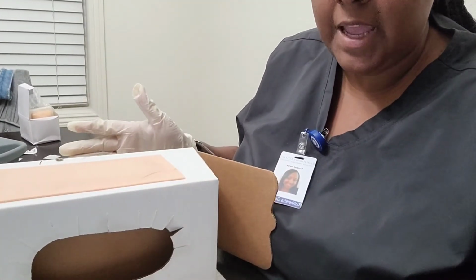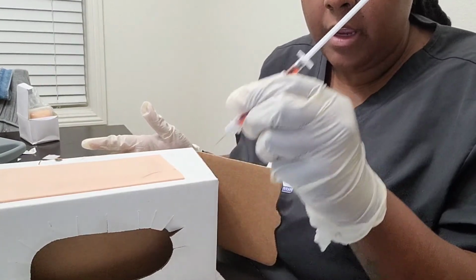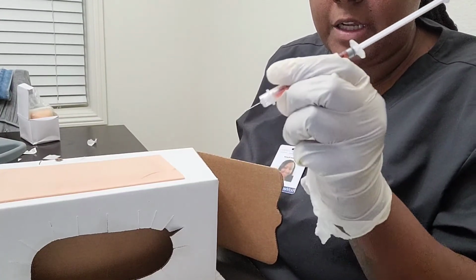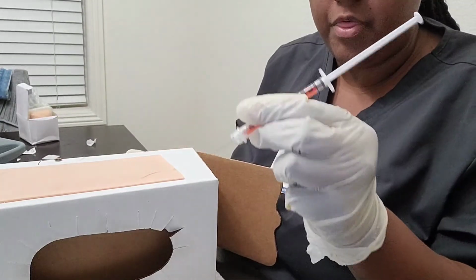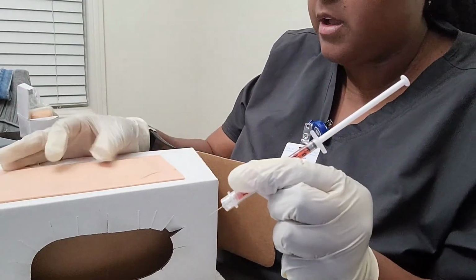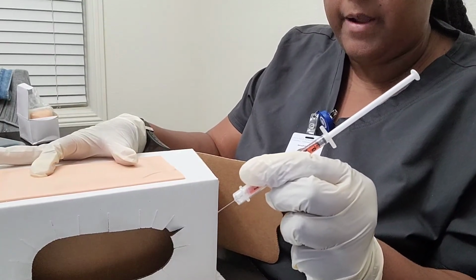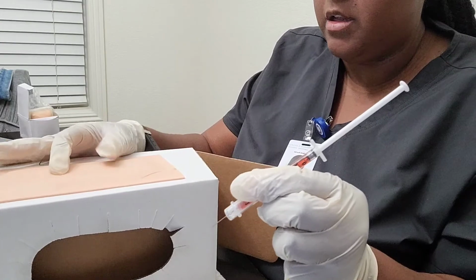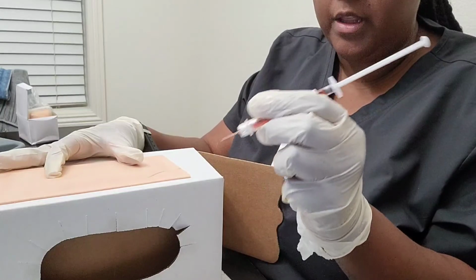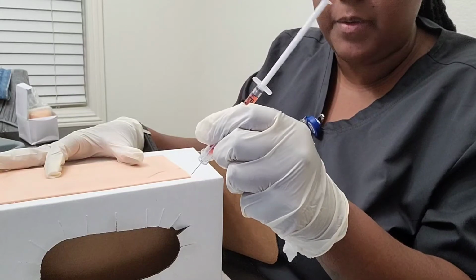Okay, so the site is now dry. So I'm going to go ahead with my dominant hand and hold the syringe in my hand, holding it like a dart. Okay, with my thumb and my 4 fingers right here, and I'm holding it as a dart. And then using my thumb and my finger with my non-dominant hand to spread the skin, I'm going to spread the skin. I'm going to hold the syringe at a 90-degree angle into the muscle. Okay.